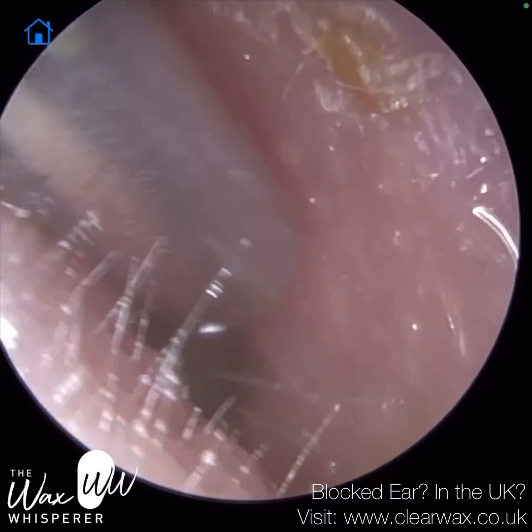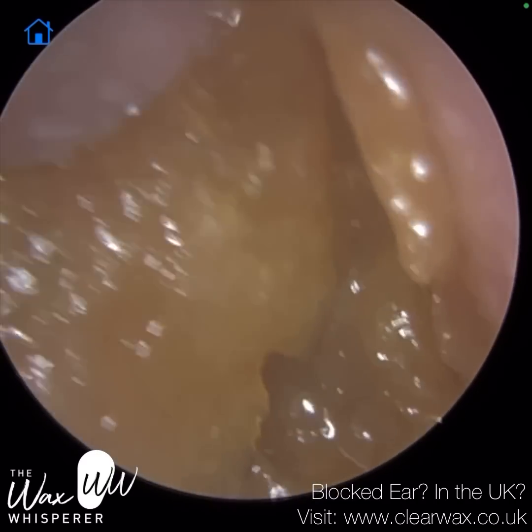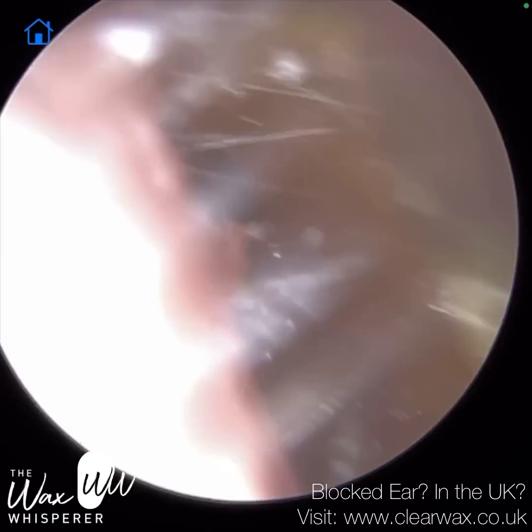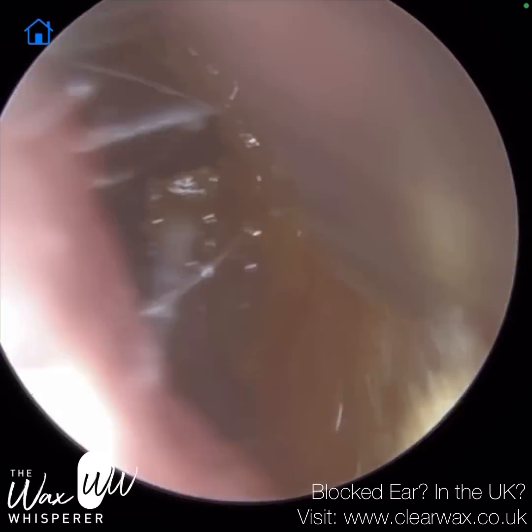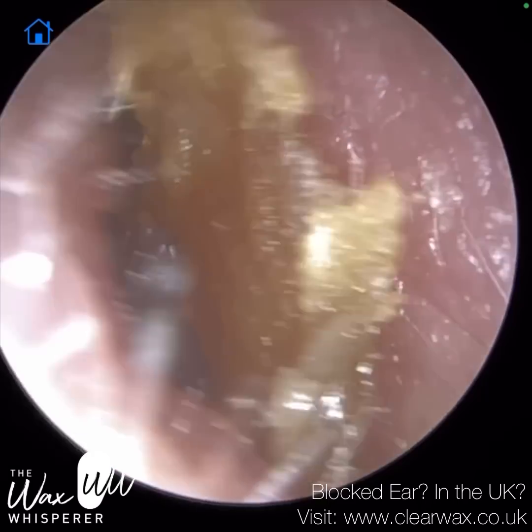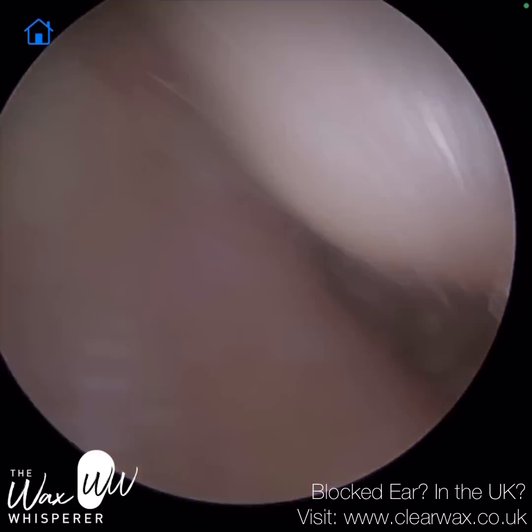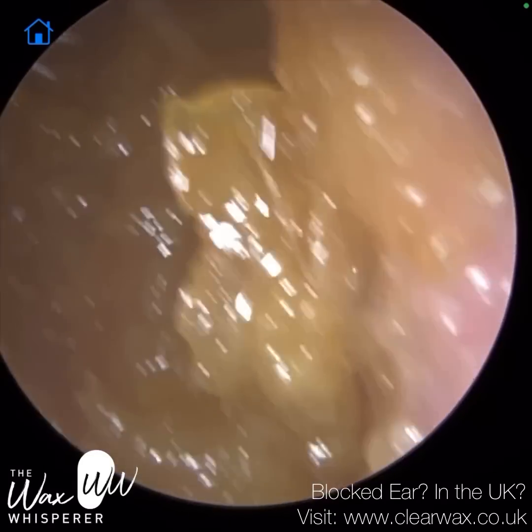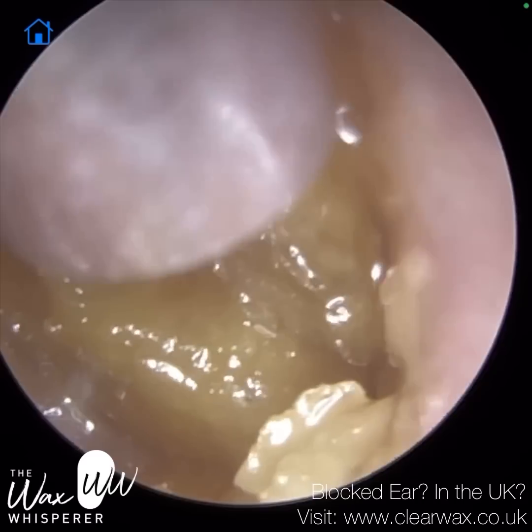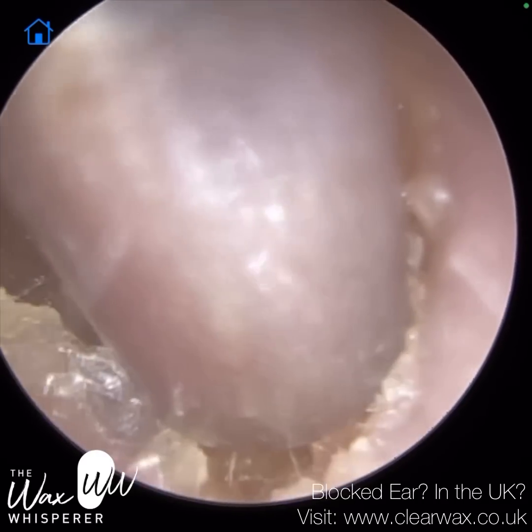That skin was formally lining the ear canal wall. Since that skin has died and shed, it's been replaced by another layer of skin underneath that has pushed it off the surface. That skin would normally come out of the ear by itself — the ear cleanses itself, extracting and allowing dead skin to migrate out. It's a self-cleansing mechanism. But in this instance, that skin has attached itself to this wax plug and formed part of it, so a lot of this wax plug is also made up of dead skin — those layers of skin that were originally on the canal wall.